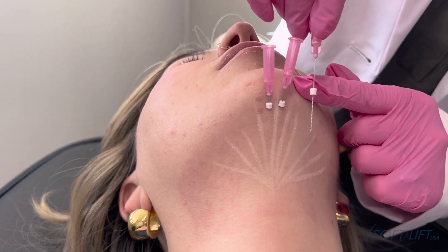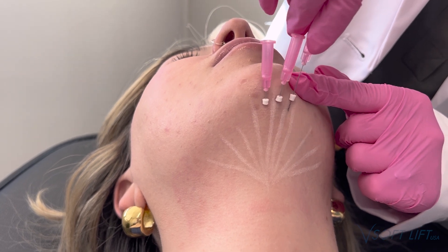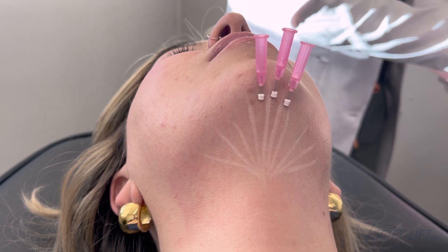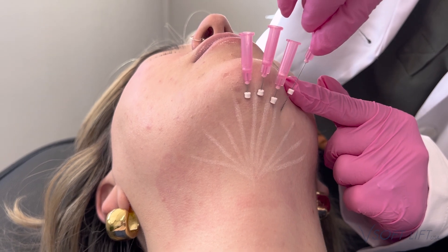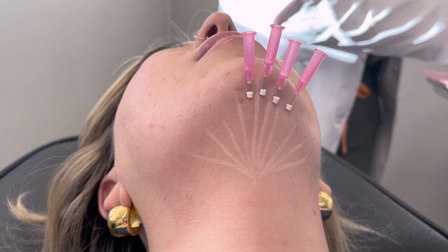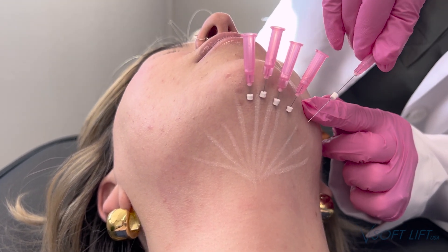For this patient, we chose a total of 10 threads and I did kind of a sundial pattern, you could say. You could also crosshatch and do more threads — it just depends on the starting point that your patient is at when you're choosing your treatment plan. For her, we did 10 threads total. You could always crosshatch on top of that and place another 5 or 10 threads as well.